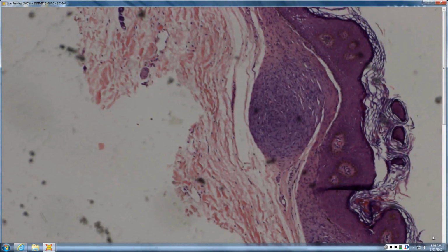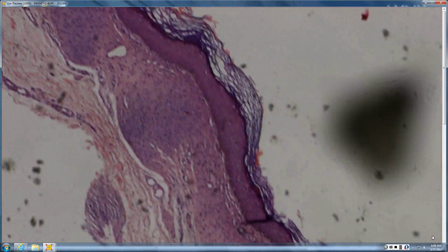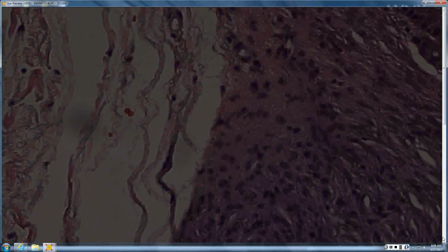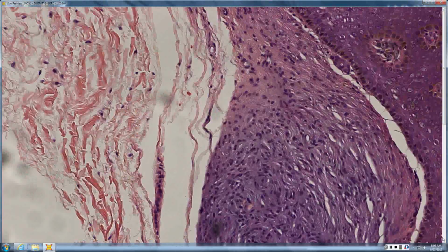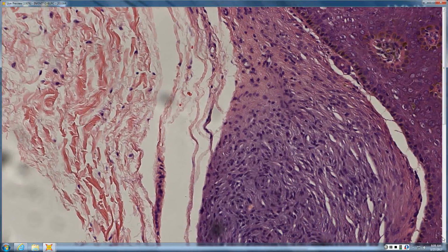It's like really superficial nerve-looking tissue there. So superficial, and if you had to describe a vegetable that has a similar concentric pattern. Perhaps like a leek.